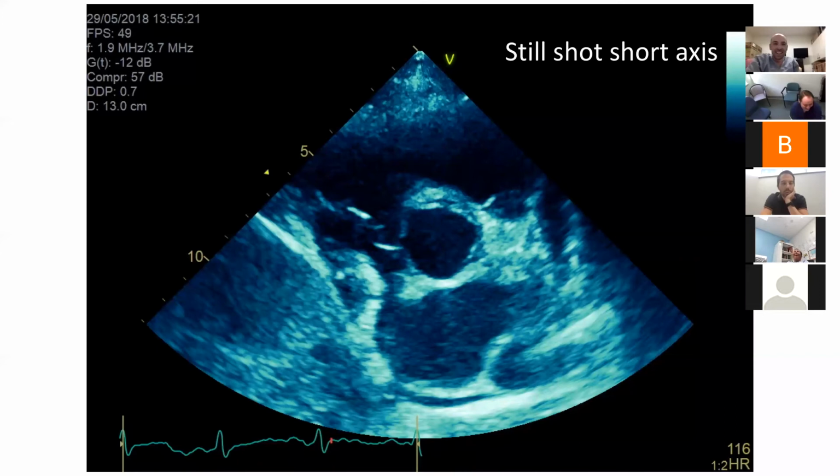So here's a still shot of the short axis early in systole. Okay, so early systolic collapse of the right atrium is evident there. Left atrium's not collapsed. There's a small pericardial effusion posterior to the left atrium.